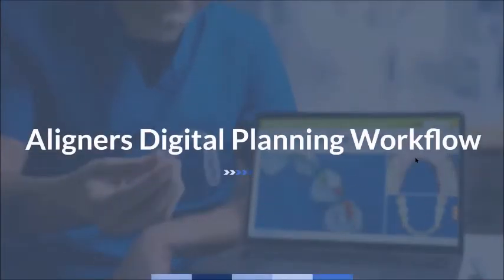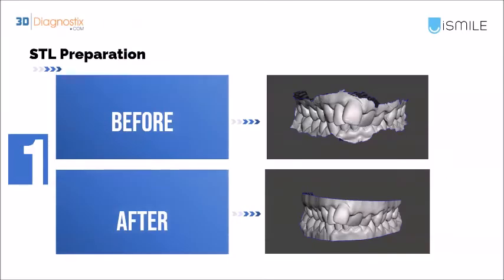Moving on, we have the aligners digital planning workflow. In our aligners digital workflow, we use two main softwares. We use what we call the CAD software that we need to do our STL preparations. We need to prepare the STL before importing them to the planning software, and I'm going to explain what preparation means.